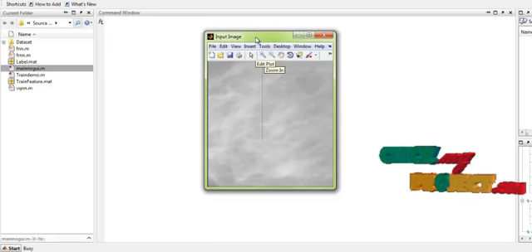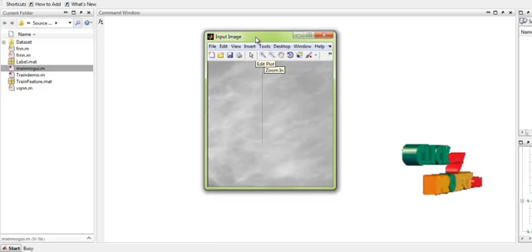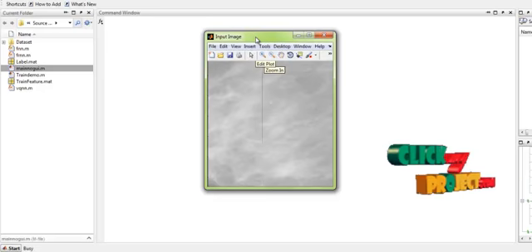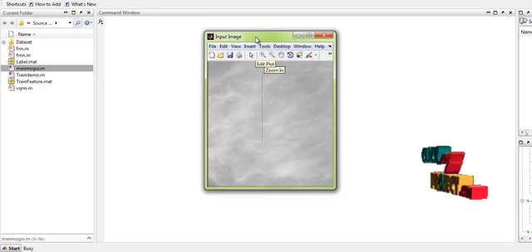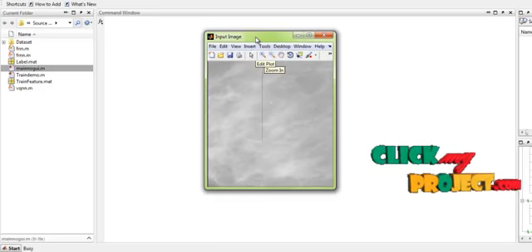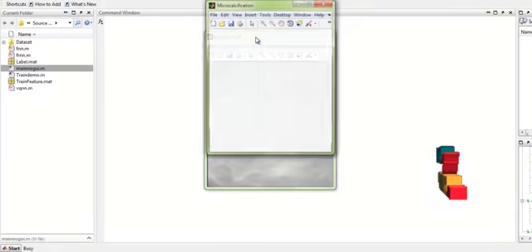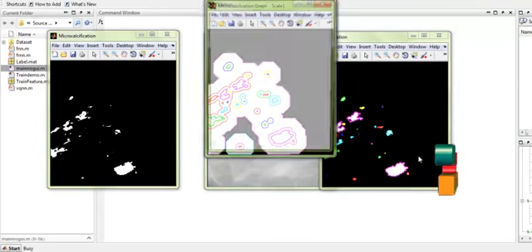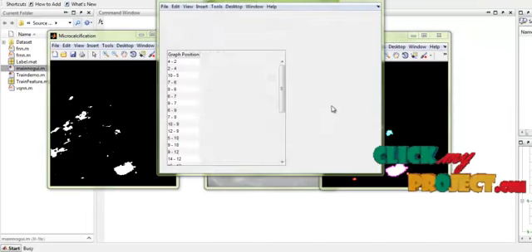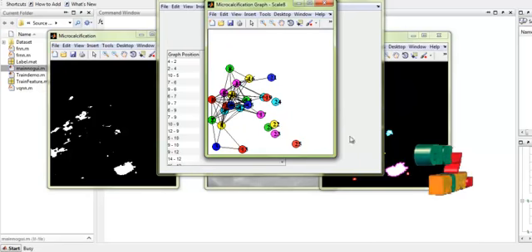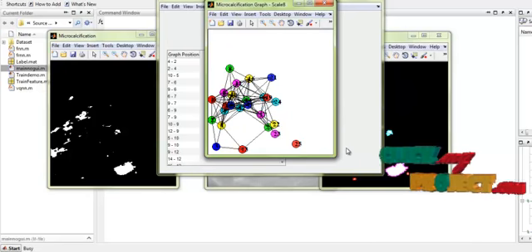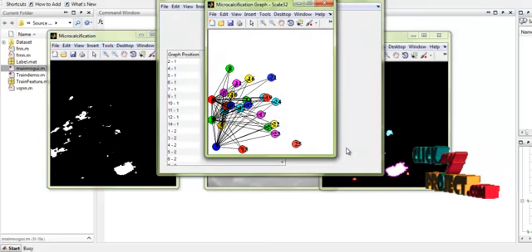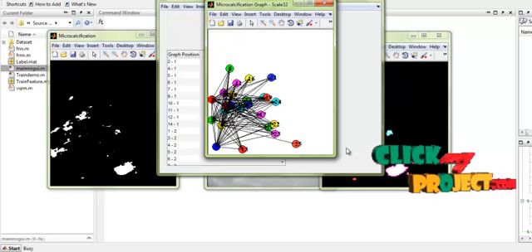The first step is identification of the calcifications in the input image. The calcification regions are higher in intensity compared to the surrounding areas, so the regions are identified and the microcalcifications in the input images are obtained. Then the dilation process is applied in three steps, followed by graph identification and combination of the nodes.